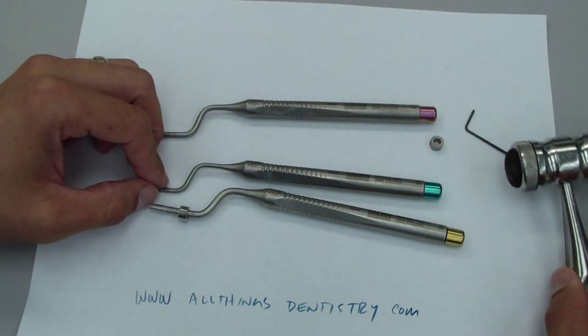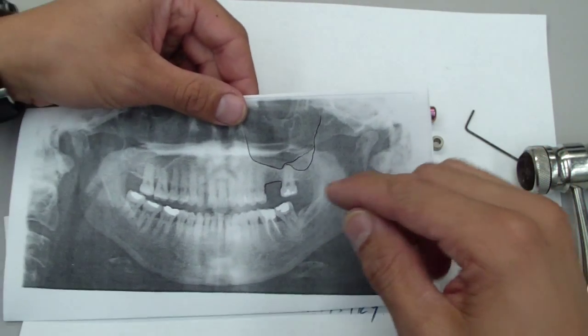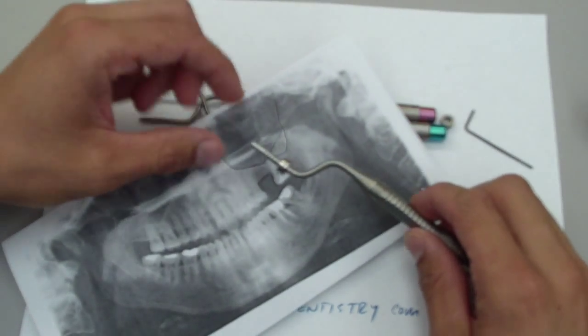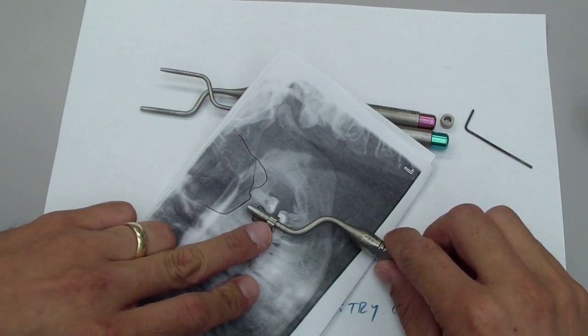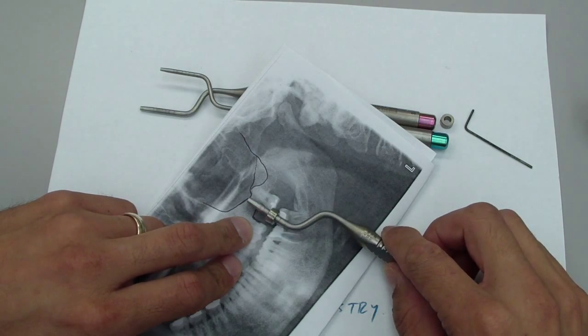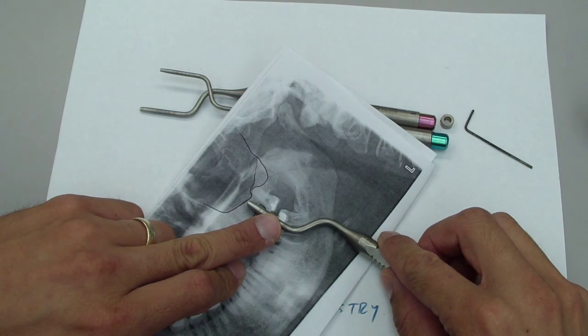a little cup to put bone. The way that you use these — this is one way to augment the sinus with bone when you place an implant. So what you would do is set your little gauge to whatever length you'd like, tighten it, drill a hole — essentially called an osteotomy — and then slowly, approximately two millimeters from the floor of the sinus, start tapping.